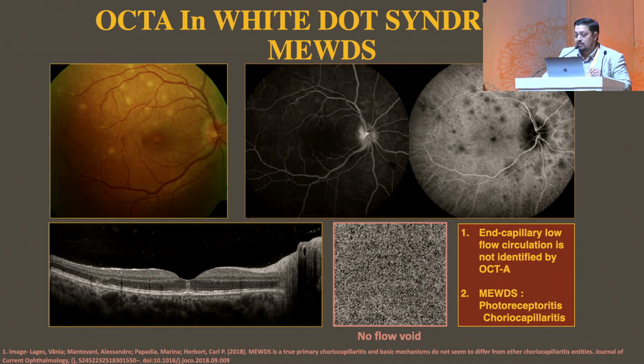Another white dot lesion is multiple evanescent white dot syndrome, which looks like these pinpoint white lesions, seen on OCT as outer segment loss, photoreceptor segment loss. On ICG in this patient, again you see these hypofluorescent areas. But when you do an OCT angiography in these patients, you don't see any flow void areas in the choriocapillaris plane. This is where the limitation of OCT angiography helps you refine the diagnosis.